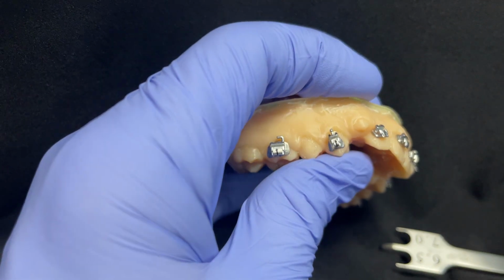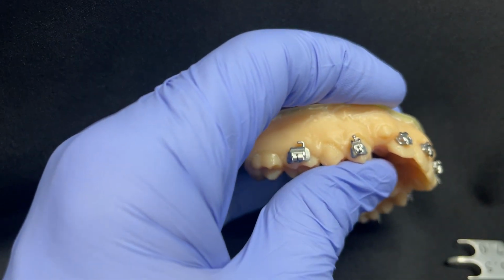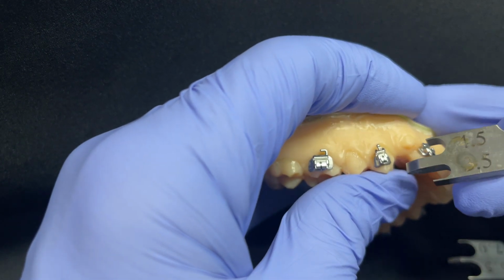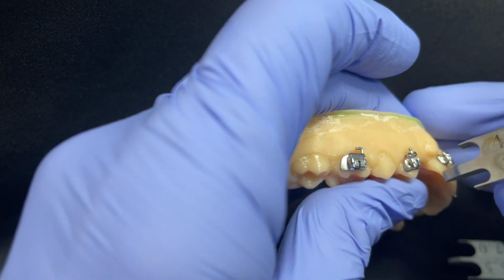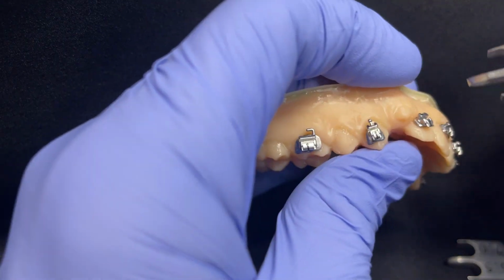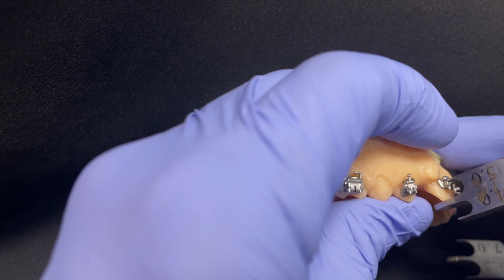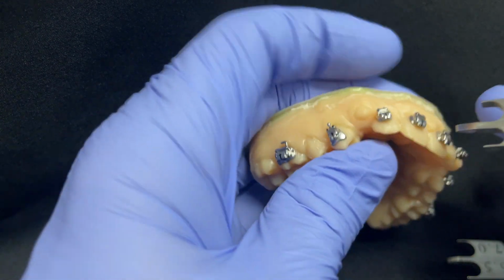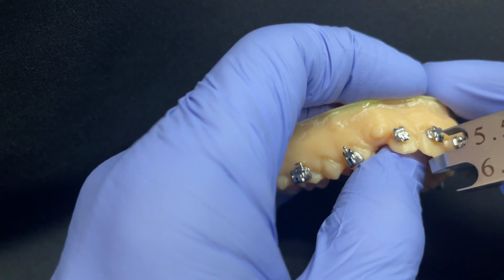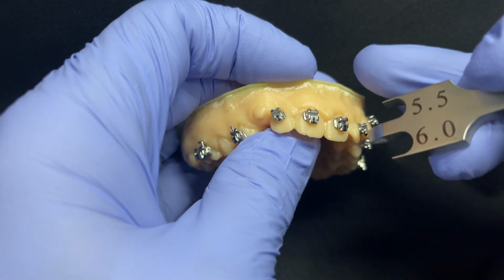All right, I'm getting my numbers mixed up here in terms of the table. So my point is, if you move that premolar down just a little bit, then that means you can, all right, so what do we say here? This is 4.5. That means that the cuspid and the lateral are both going to be at 5 millimeters. All right, let's move those down to 5 millimeters now. Okay, and that means that this central incisor should be at 5.5 millimeters, just in case we didn't want to move it all the way up to the gingival margin there.